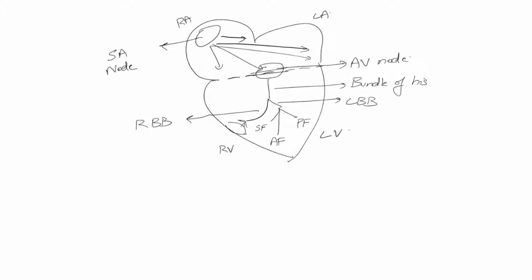So we've said that we're trying to get whatever is happening in the heart onto a piece of paper. And if you think about it, there are really three things that you want to figure out in terms of the flow of electricity. The first one is which way is the direction of depolarization or repolarization. The second thing that you would try and define is how intense is this wave of depolarization or repolarization. And the third thing is how do these waves change over time? To figure this out, we follow a specific convention.